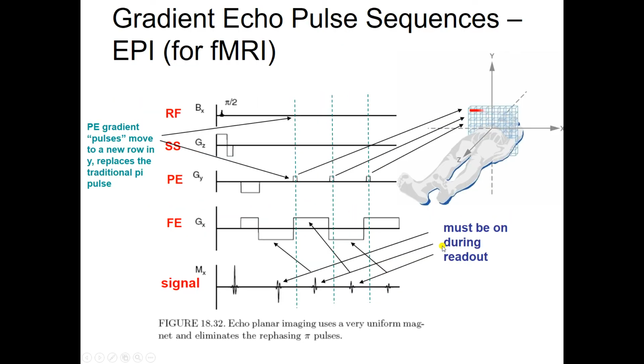Let's just let this thing play. Blip, read out a row. Blip, read out a row the other way. Blip, read out a row the other way. So look at what's happening up here. See how before you were resetting the experiment every time and starting from left to right? This is just going to move you through the whole slice very, very quickly.